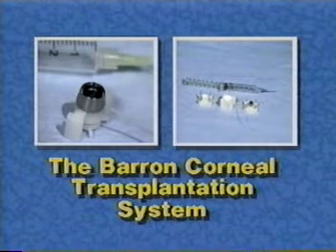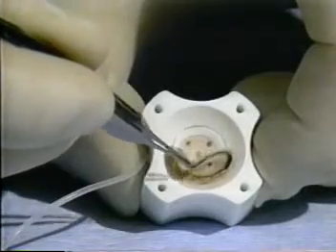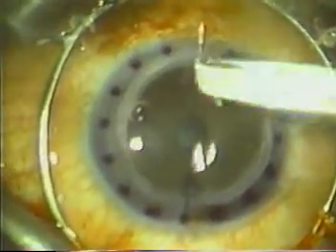The Barron corneal transplantation system allows the surgeon to make predictable and regular matching cuts of both the recipient and donor corneas while accurately marking them for even suture placement. Now being used extensively, the Barron system is easy to operate, disposable, and inexpensive.